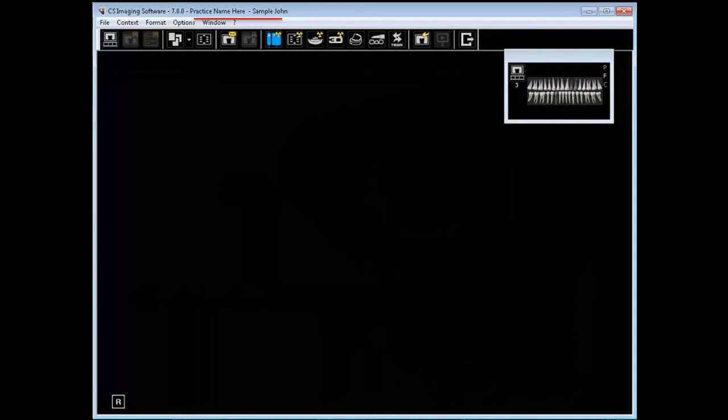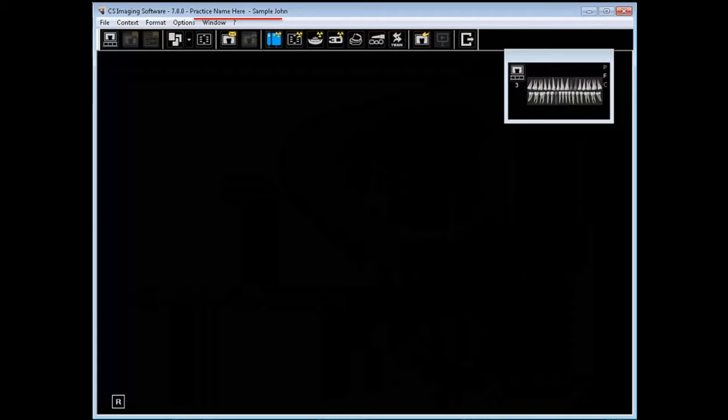By default, CS Imaging captures the name of the workstation. The practice name can be modified in the preference settings. Changing it will not change the workstation name, but will change the name of the practitioner within the software for displaying and printing purposes.